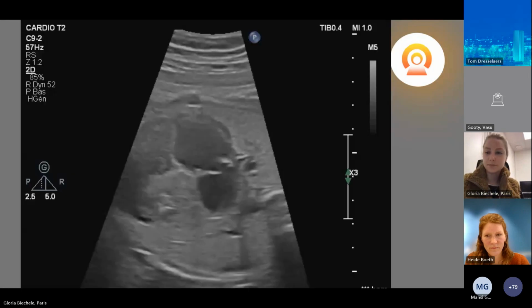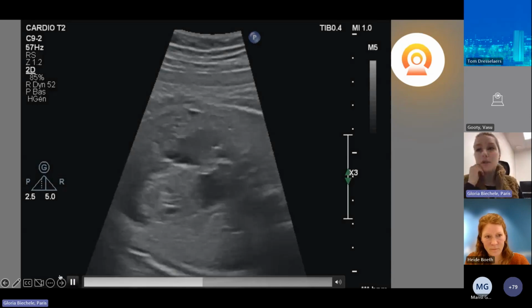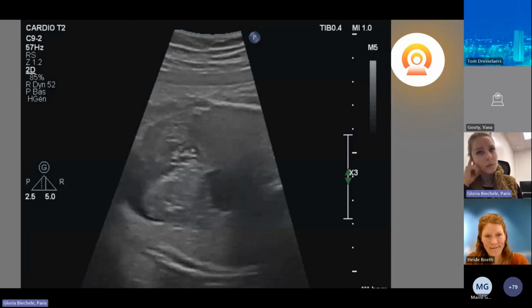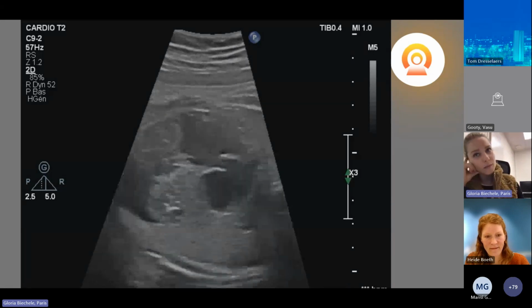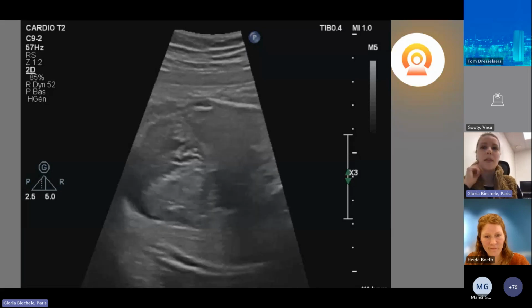So, after the weekend and at the day of the MRI, the first ultrasound was performed on a Thursday, and then the MRI and the second ultrasound on the Monday. So ultrasound was repeated and confirmed a voluminous iso- until hyperechogenic tumor of the left ventricle, limiting opening kinetics of the valve and considerably reducing the ejection pathway.